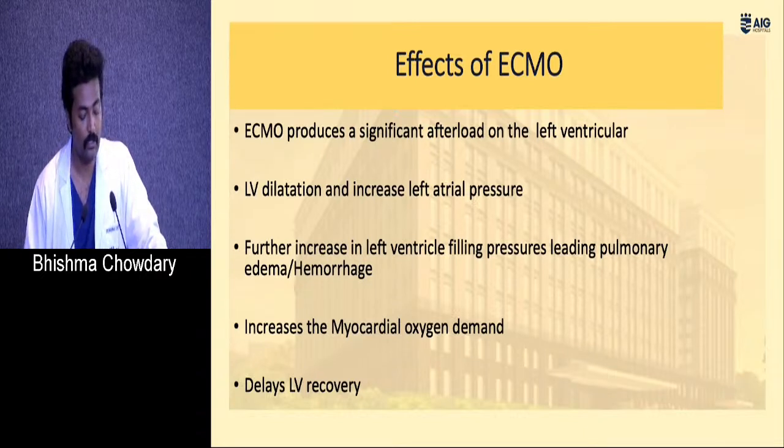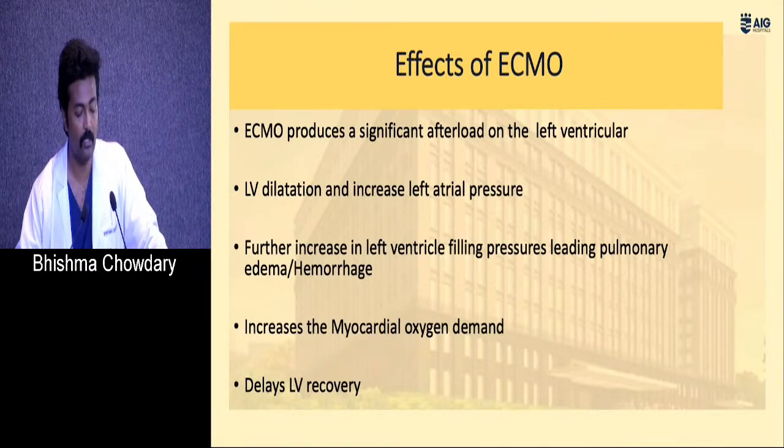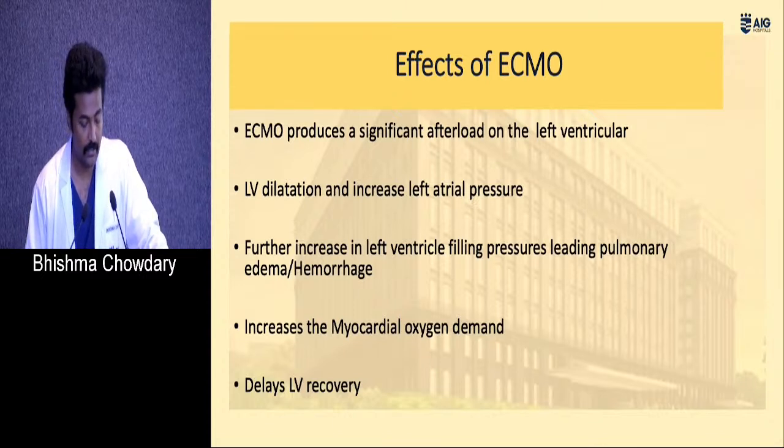So we thought there should be another option where we need to unload the LV further, which helps the LV recover faster, because stress cardiomyopathy needs absolute rest so that it recovers faster. So we again had a heart team meeting. Even though we know the cost constraints, we had a detailed discussion with the family and told them the options of further LV unloading. The family immediately accepted, and we went ahead and put in an Impella the next day.